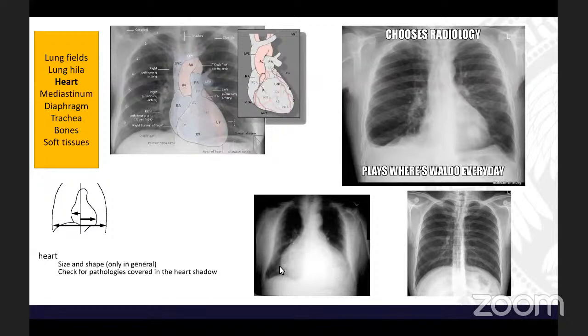Be careful anyway about changes in the heart shape over time. It means if you have a patient with a heart like this, and you have a previous X-ray from, for example, a year ago or half a year ago, and the heart was like this, it's usually not because of heart enlargement. It can be due to pericardial enlargement, and pericardial effusion is really important to diagnose. In the textbooks, they will tell you how to distinguish pericardial effusion, like it's a bag of fluid or something. This can definitely suggest pericardial effusion, but again, it's not 100%. You can't count on that. But if you have positive dynamics in the heart size over a short time, it can be due to pericardial effusion. Be careful about that.